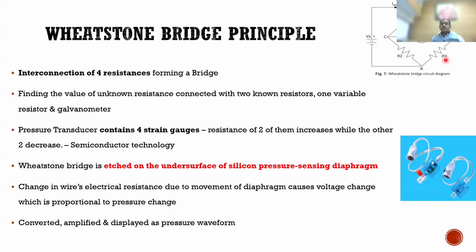This change in resistance is actually measured, and it is converted, amplified, and displayed as a pressure waveform. So you have to mainly remember, this is a common exam question, that this is the Wheatstone bridge principle, on which this pressure transducer is based.